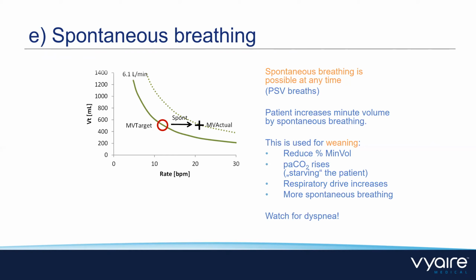You also have to think about that the minute volume you adjusted is what you thought would be sufficient for the patient, but when the patient is breathing spontaneously, he is doing what he's comfortable with. So if the actual minute volume is beyond what you set, you maybe should consider to support the patient by also increasing the minute volume even when the patient is breathing 100% spontaneously.